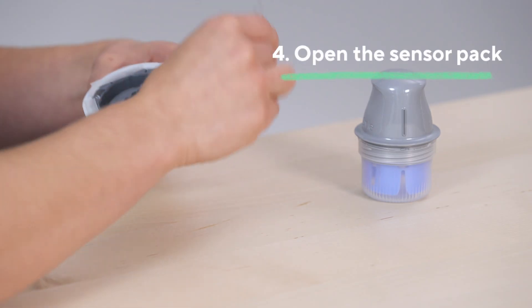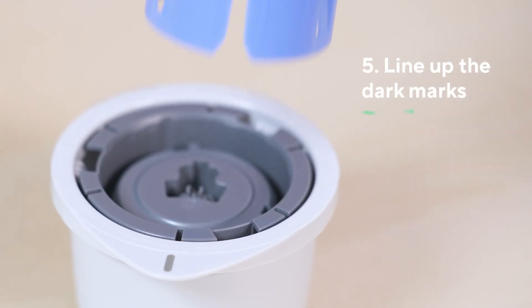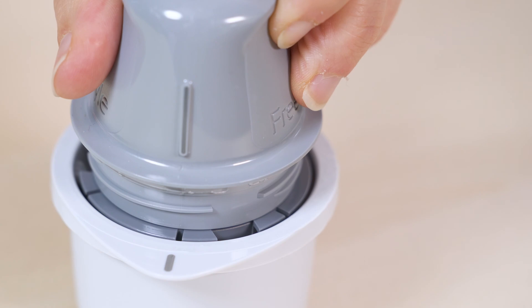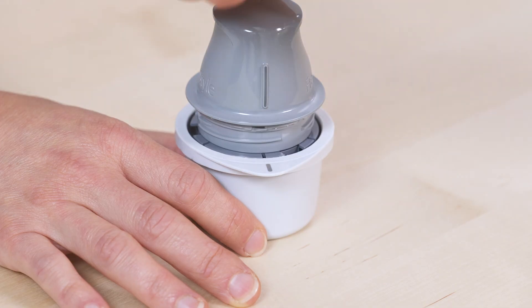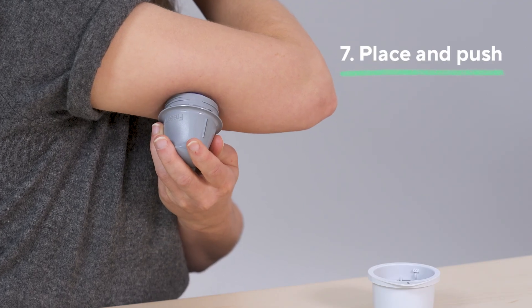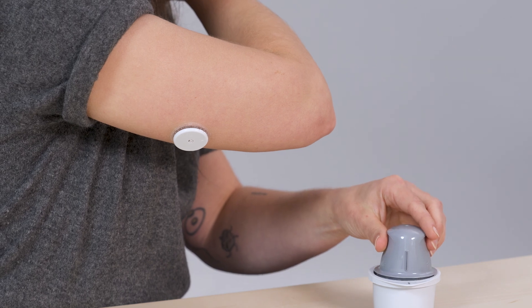Open the sensor pack by peeling off the lid completely. Line up the dark mark on the sensor applicator with the dark mark on the sensor pack. On a hard surface, press firmly down on the sensor applicator until it comes to a stop. Next, place the sensor applicator over the prepared site and push down firmly to apply the sensor. Pull the sensor applicator away from your body.